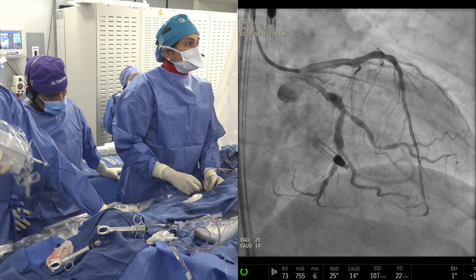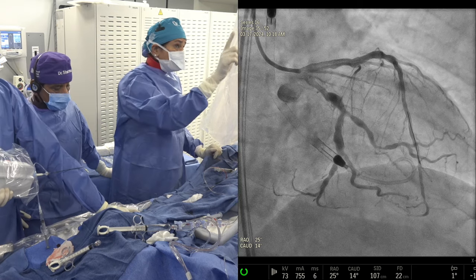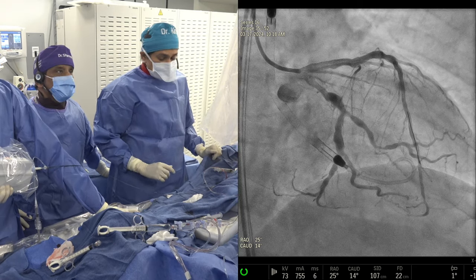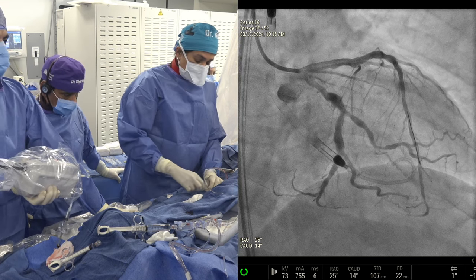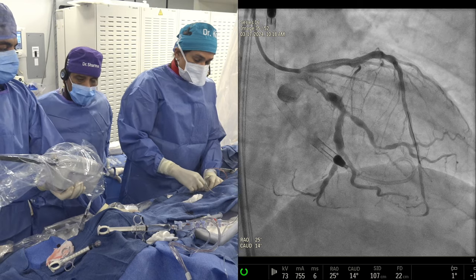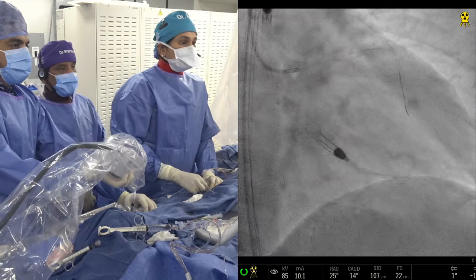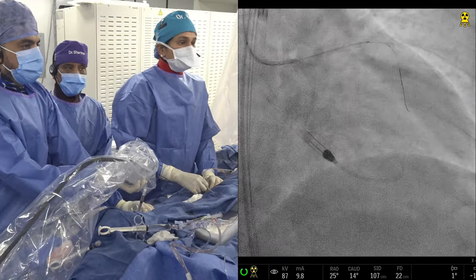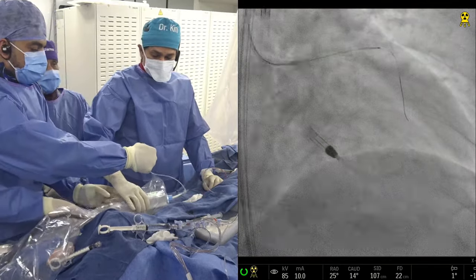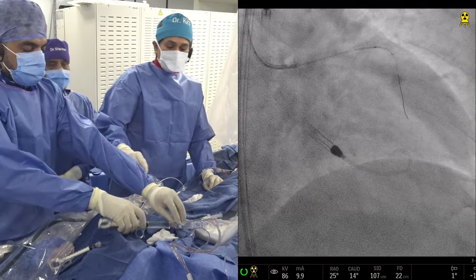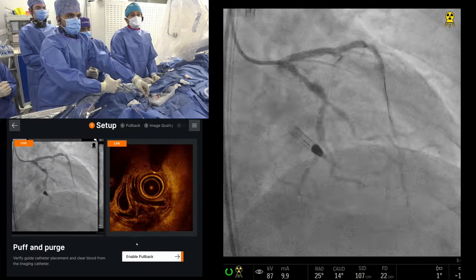Here, where the lesion was, it was not calcific but there was a lot of ectasia. For proximal LAD, proximal RCA, proximal circumflex, and left main — all of those we have to optimize. If you know the vessel size from your pre-imaging, you know you'll need a certain balloon or stent, and moderate pressure may not be fully adequate. So there's no reason to do IVUS or OCT in between — optimize and then finish it. About 60% of stents are under-expanded after placement and you can't tell angiographically, so either routinely post-dilate or serially image.